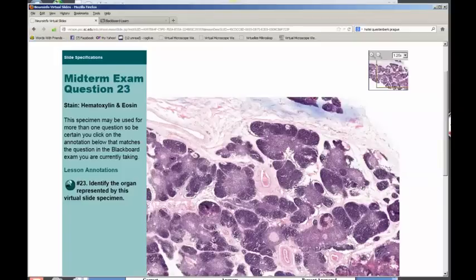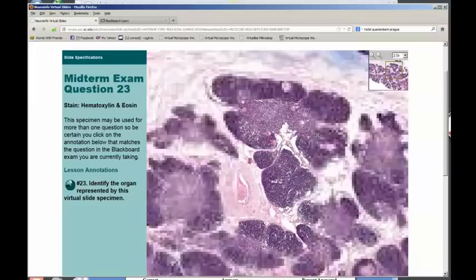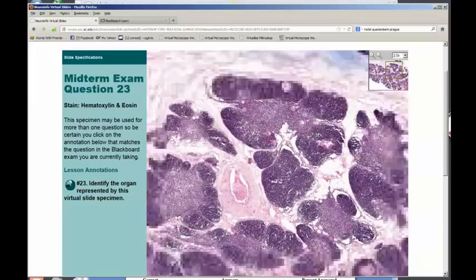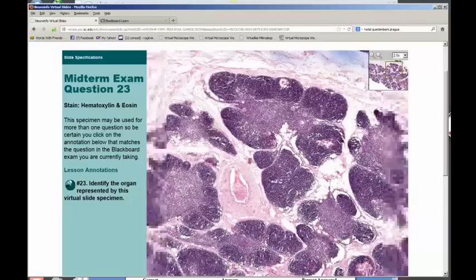So with the basophilia and what you've studied in the midterm modules, you should be thinking of lymphoid organs, and you should be thinking of one with a cortex and a medulla. So how do you know for sure which organ this is? Well, what could it be? If it's one of the lymphatic organs, it has to be lymph nodes, spleen, thymus, or tonsil, right?